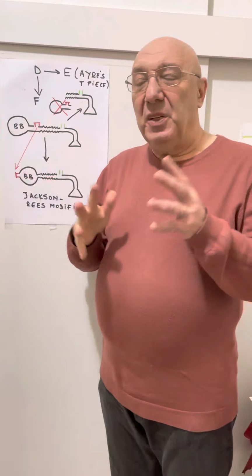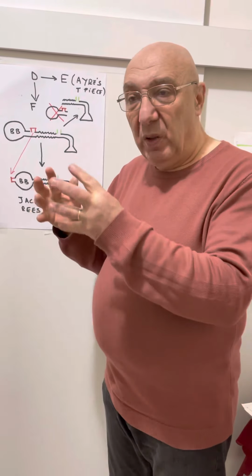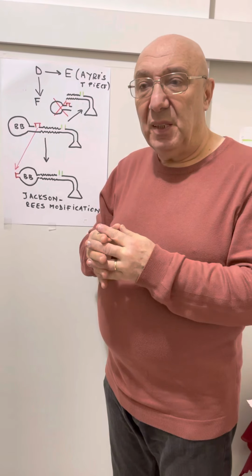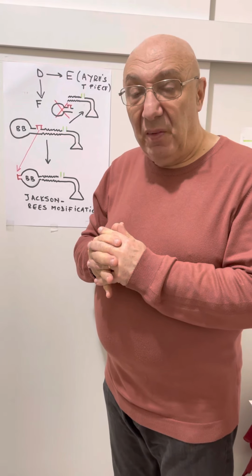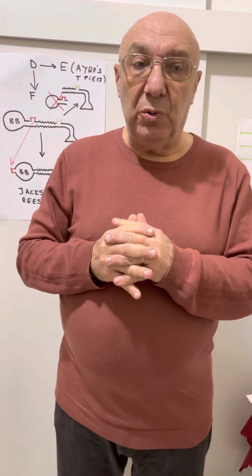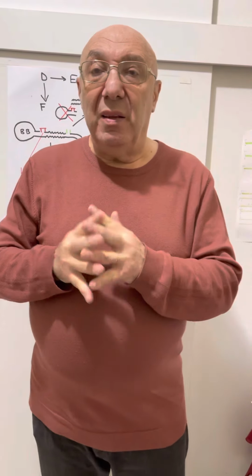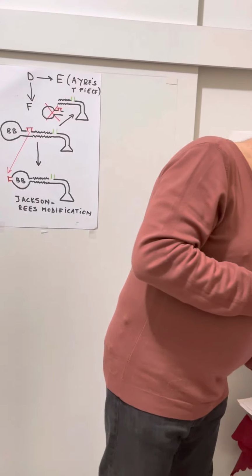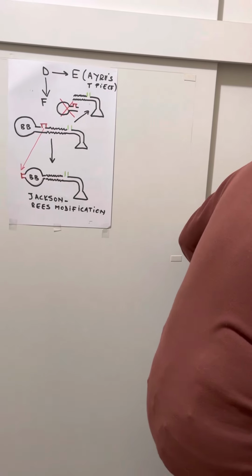Now, this classification might be a little bit obsolete, and we all know that having all the components, each and every one of us can do a perfectly safe anesthesia. The only problem is that you need to modify a lot of the flows in order to get to whatever you need. And if you go to the book, excuse me for a second, I want to show you something.